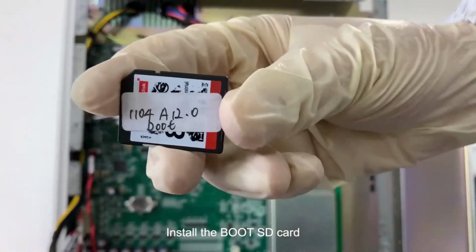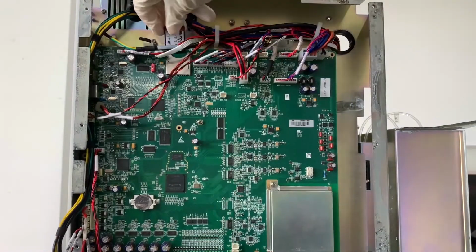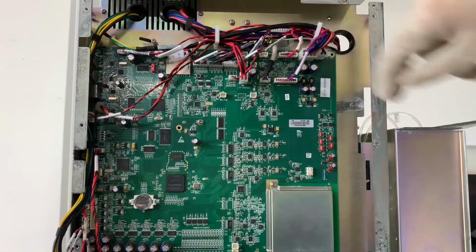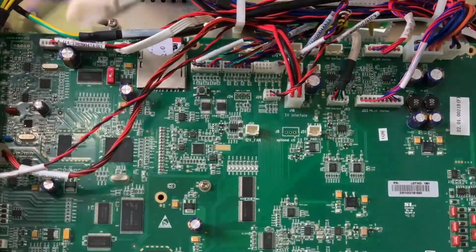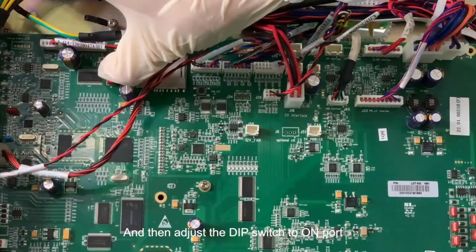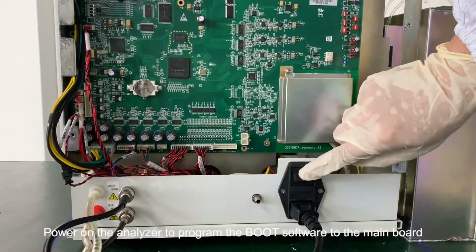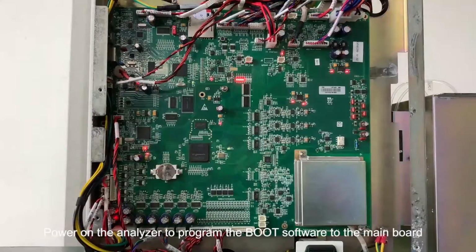Install the boot SD card. And then adjust the DIP switch to on port. Power on the analyzer to program the boot software to the main board.